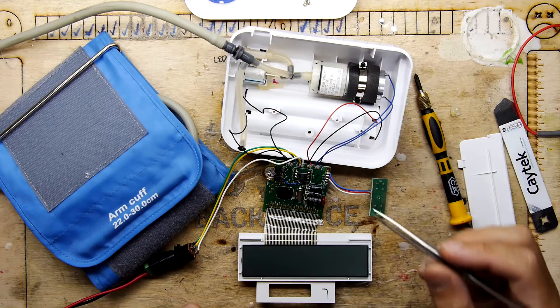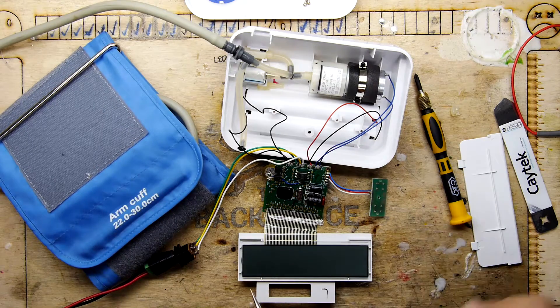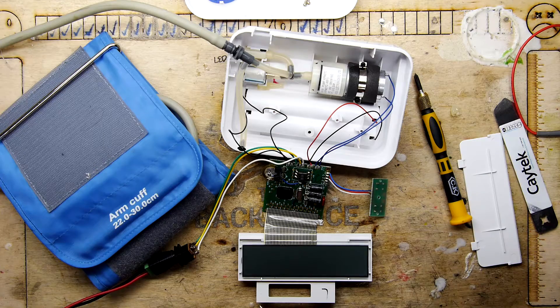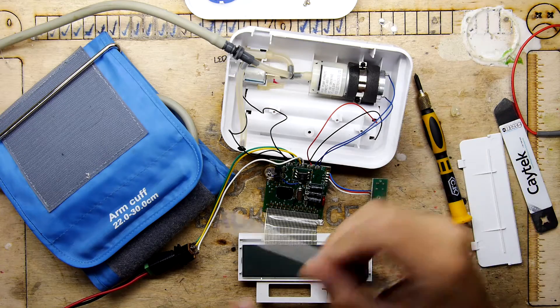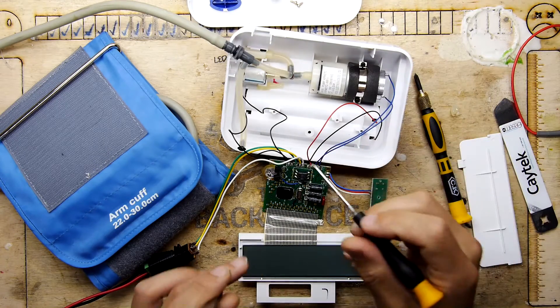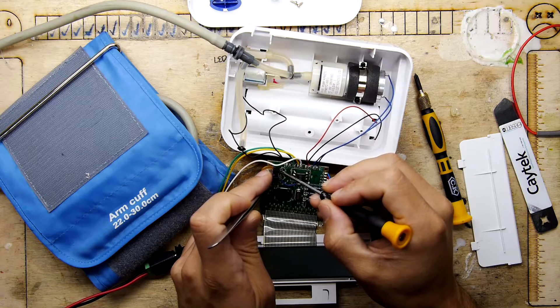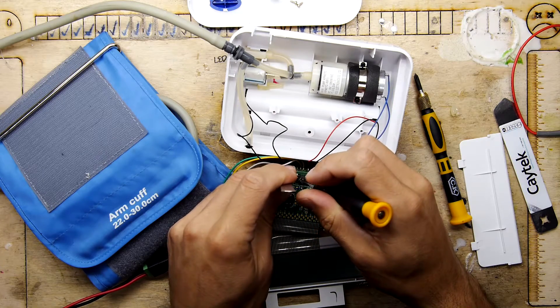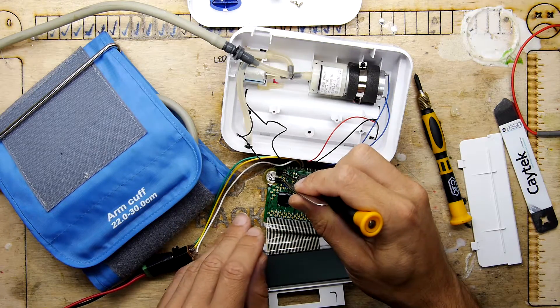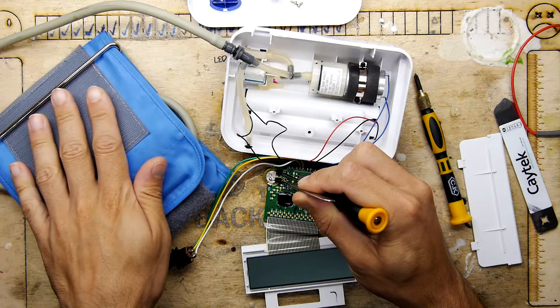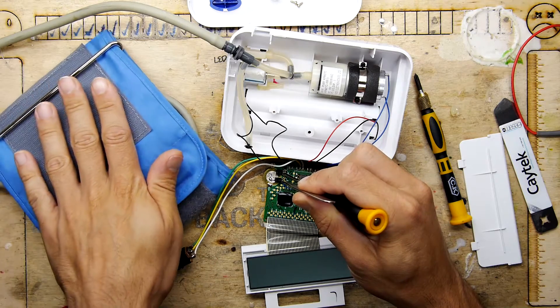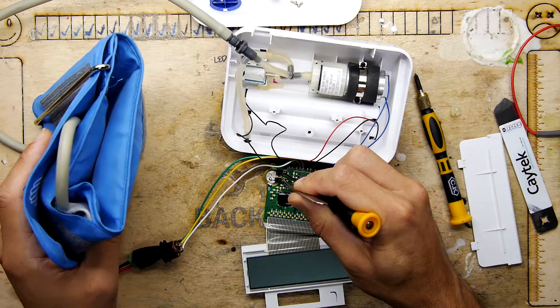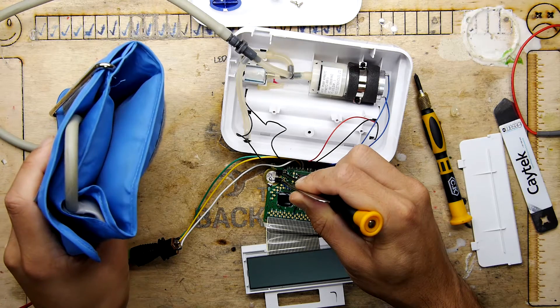And the other one, of course, is the motor. So to play with this, though, you have to short two things out at once. So I've got one shorting tool and I've got another shorting tool. So we'll close the valve and then we'll short the motor. And you can see that is inflating.